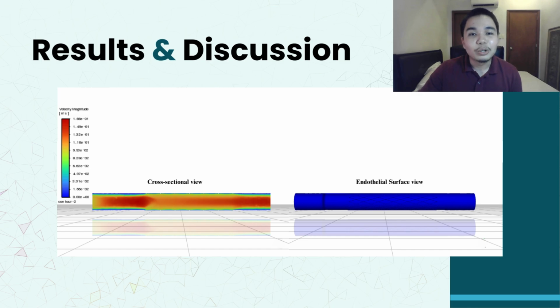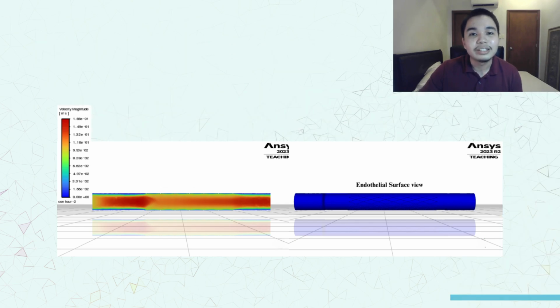The cross-sectional contour plot displayed above exhibits the parabolic velocity profile that is characteristic of laminar flow. The profile bends in one direction due to the asymmetrical distribution of shear forces cast by the opening of the curved beam harvester situated at the upper side of the plot. The higher velocity gradient near the device's walls exhibits the shear thinning nature of a non-Newtonian fluid. The velocity profile is much less defined in the area enclosed by the stent due to the disruption of flow created by the stent struts, leading to a more homogeneous distribution of velocity.